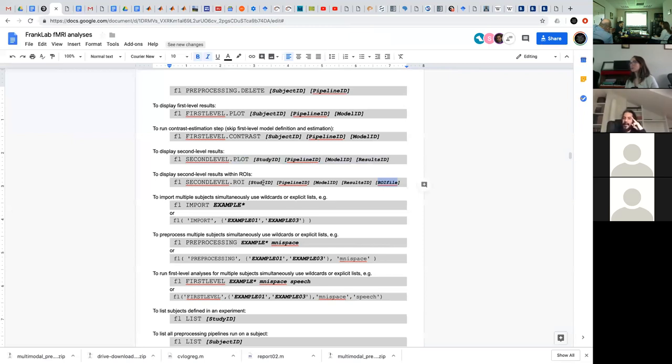Yeah, and all modern variations of MNI use slightly different procedures, because they no longer use this kind of spatial warping technique to match, like cross-modality co-registration between your actual structural file or the functional file and your template. They use more complex models, so they no longer follow the same logic that was used to define this MNI 152 space, because that used the older normalization techniques.